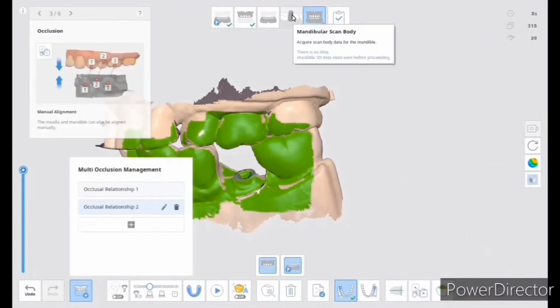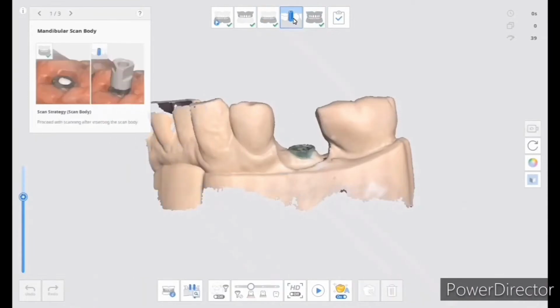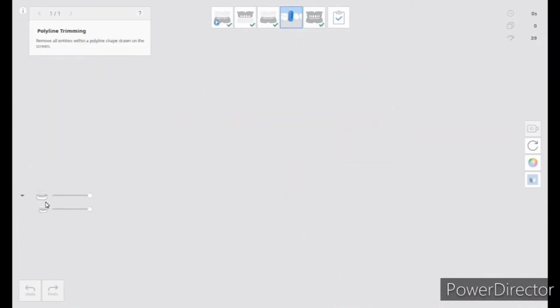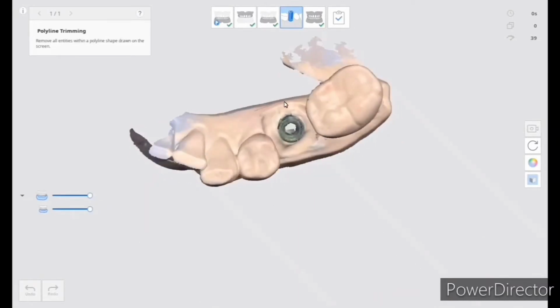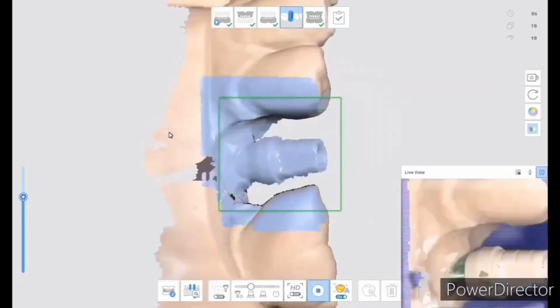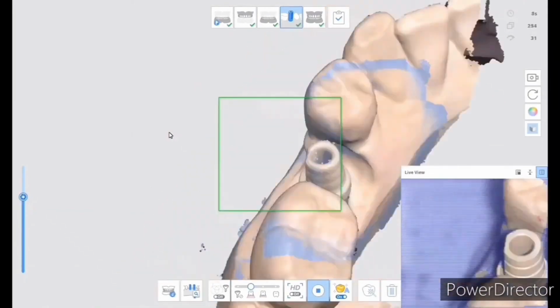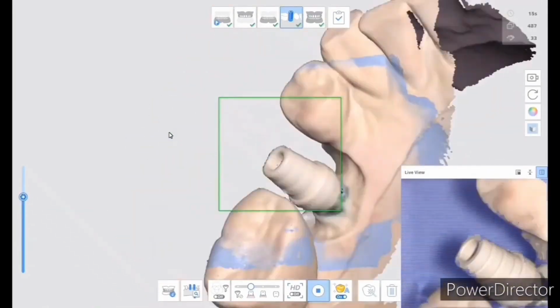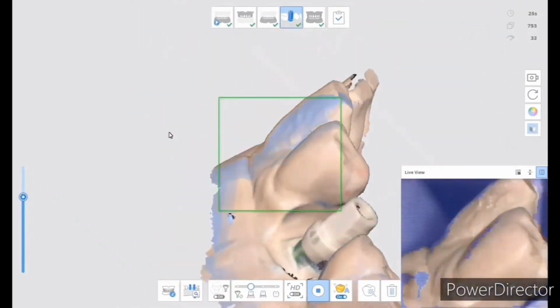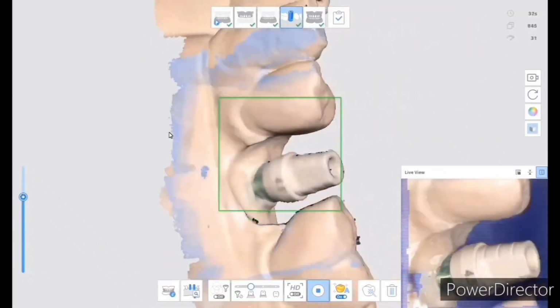All you need to do is find a projector and 2 cameras, and then stuff them into the mouth scanner. But there will be some problems. First, the projector usually adopts an ordinary LED light source, and the light intensity of an LED light source is significantly weaker than that of a laser. In this case, in the mouth, due to blood or metal teeth, the reflection of the metal scanning rod, the image contrast collected by the camera is very poor, and it is difficult to scan.